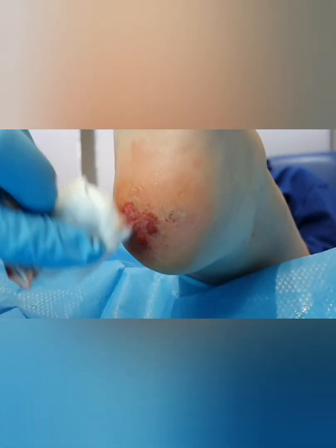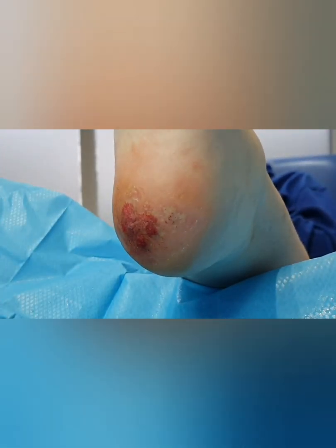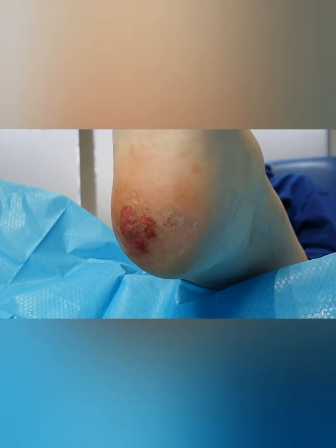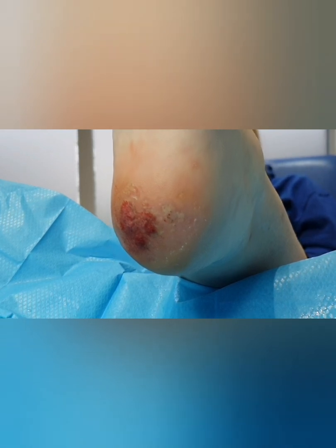Now I'm just cleaning the wound off now. We're getting there, but we're not quite where I want it to be. So the verrucas I will keep needling until they offer very little resistance. So I'm getting very little skin resistance.